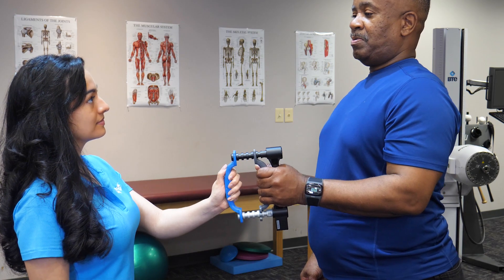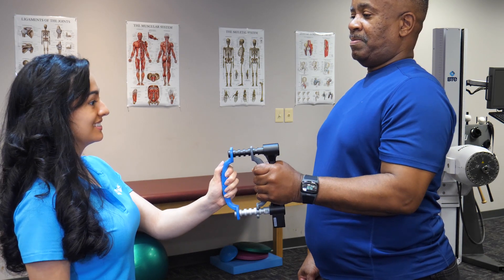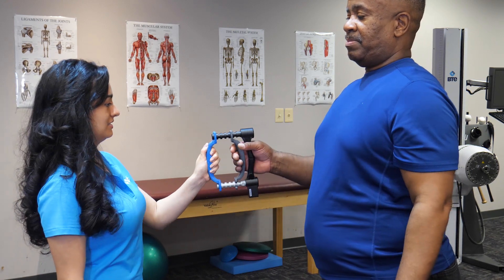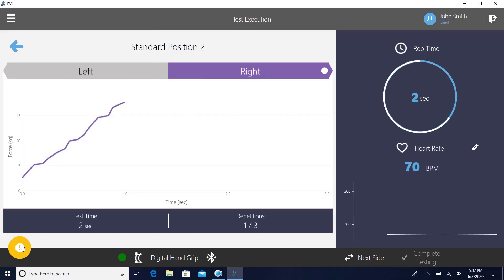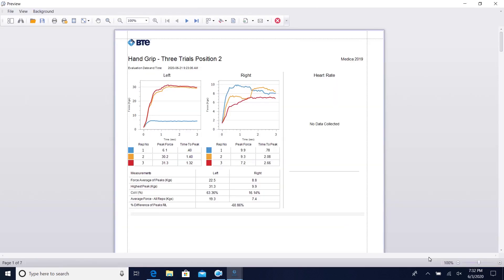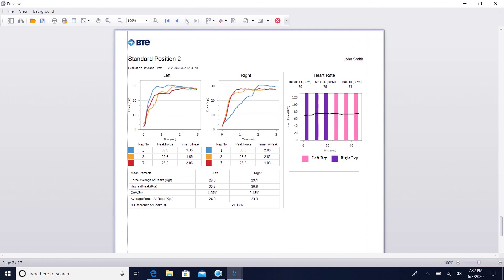The EVJ handgrip gives you everything you need to make your assessments simple and precise. Unlike the old manual way, the EVJ handgrip provides immediate objective data with forced time curves in easy-to-read reports. Your assessment report is instantly ready to view. With simple charts and graphs, you can easily filter your data, extract what you need, and export it for faster analysis.